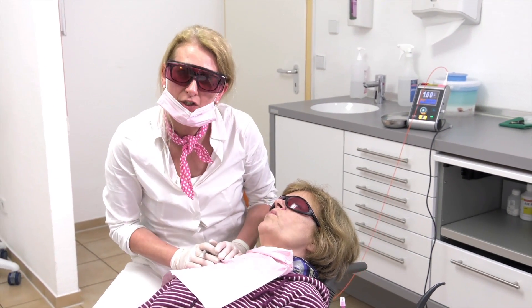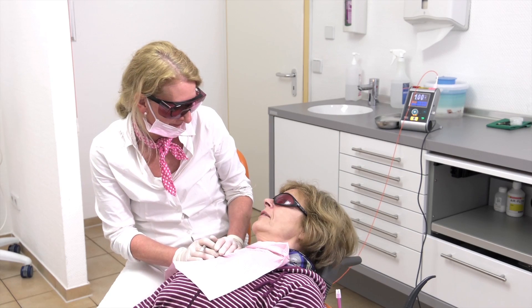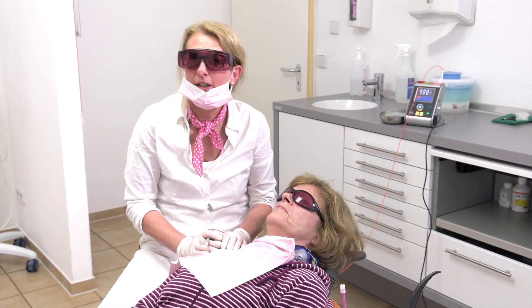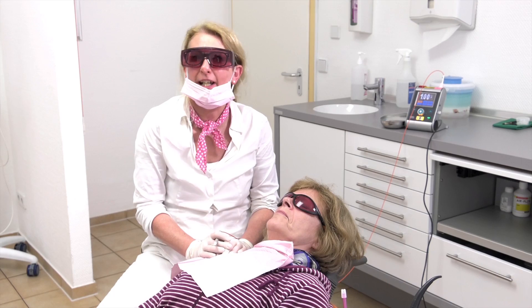Now we will ask the patient how she feels. How do you feel? I'm very fine. And you — was it painful? No, no. Okay. So, you heard it — it wasn't painful at all.